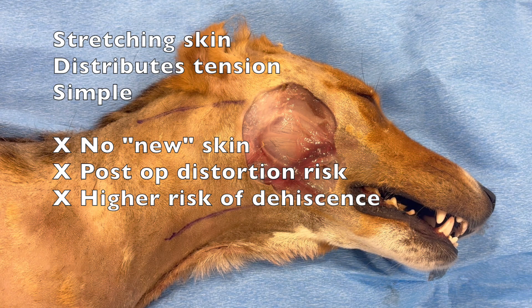It's important to note that we are not bringing any new skin to the area. It is simple, but with elastic retraction that can occur postoperatively this can induce some distortion, and along similar lines the risk of dehiscence is higher when compared to a well-performed transposition flap.